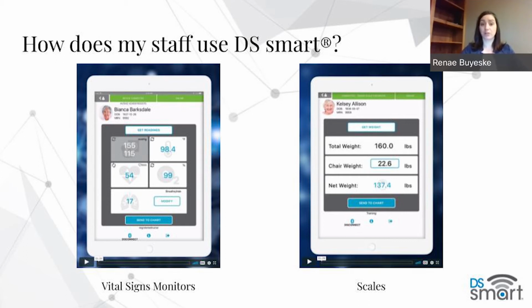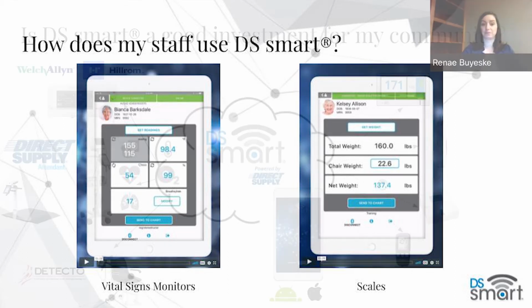Videos are available on dssmart.net if anyone is interested in reviewing the vital sign monitor video again or getting a deeper dive into the specific capabilities of the scales.